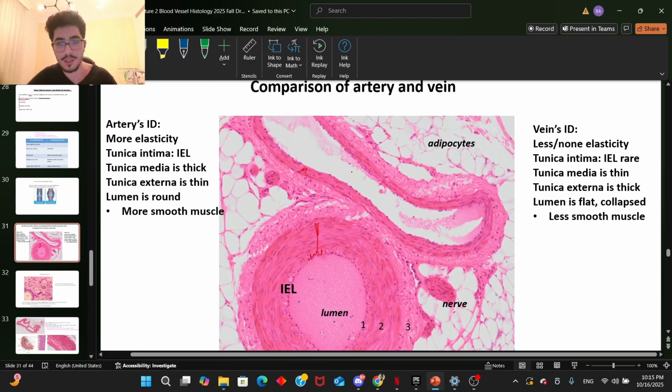So it's very important to know that the tunica adventitia in veins is always thicker than the tunica media. Look, this is the tunica adventitia, and this is the tunica media. Which one's thicker? The tunica adventitia. So this is also another way to classify veins, right? Their oval structure, because they're collapsed, because they have a thinner smooth muscle layer, and their tunica adventitia being thicker than their tunica intima. Okay? So this all says the same thing here.